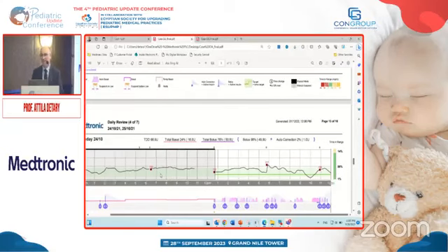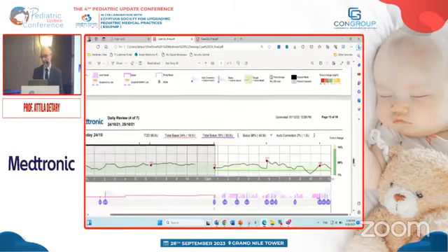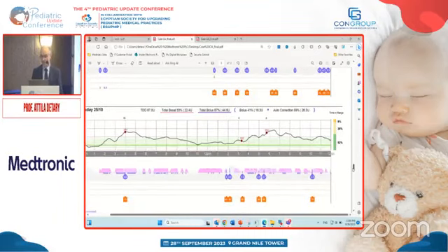So during the night, the manual basal rate managed the patient rather well, in the target range, a little bit on the top part, however, still in the target. As soon as the patient switched into the auto mode, then we see that almost all the time, there was a bit of hypoglycemic episode here, very short, but otherwise spent the time in the auto mode in the target range. So already after the switch, it works very well. The result for that day is 85% in the target. And the following days, this was not so bad.